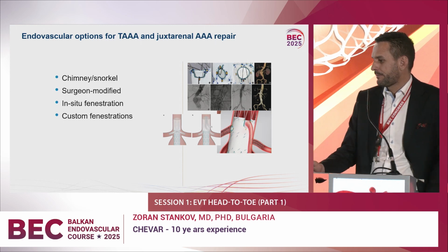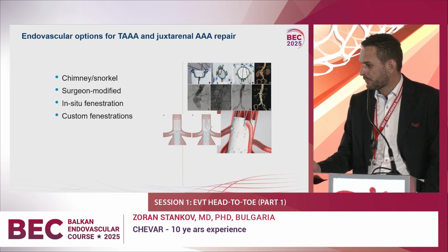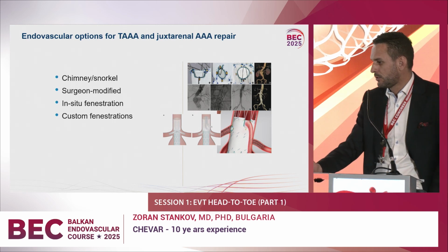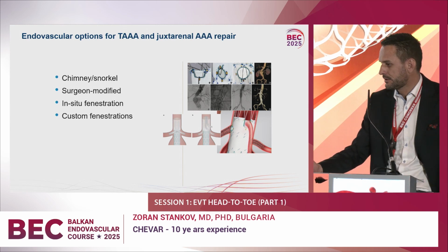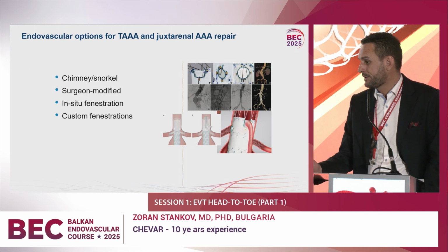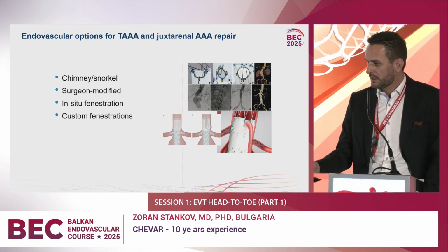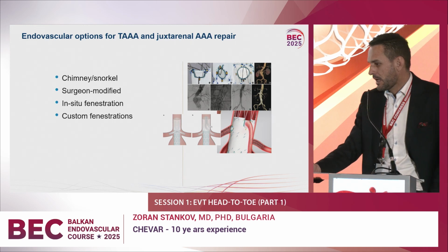We see another solution from Professor Nikolov, in situ fenestration. Tomorrow we present one live case with in situ fenestration on the aortic arch. We have used it for one year for the aortic arch, in situ fenestration, a custom fenestration.